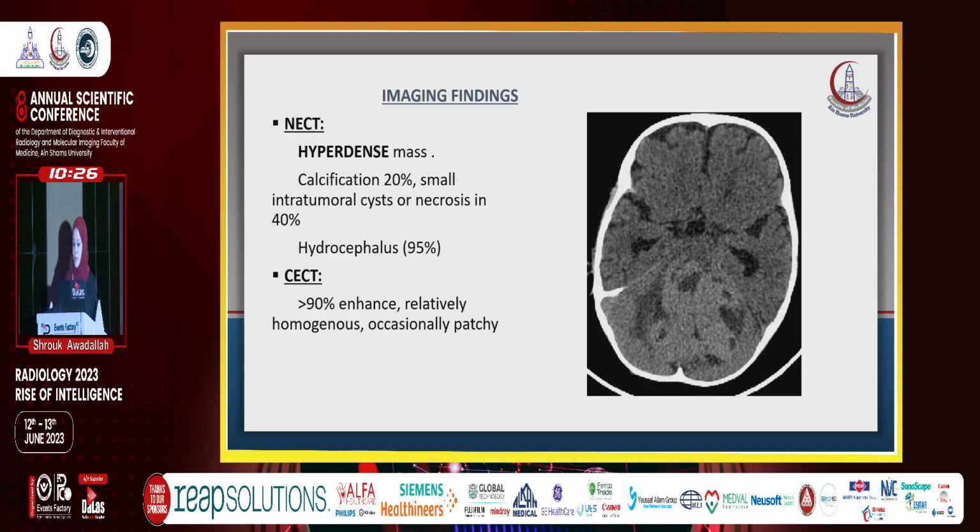Calcification may occur in about 20% of cases, and some tumors have cysts and necrosis. Hydrocephalus is a common association and common result from medulloblastoma. In contrast, enhanced CT enhancement occurs in more than 90% of cases, homogeneous or heterogeneous enhancement.